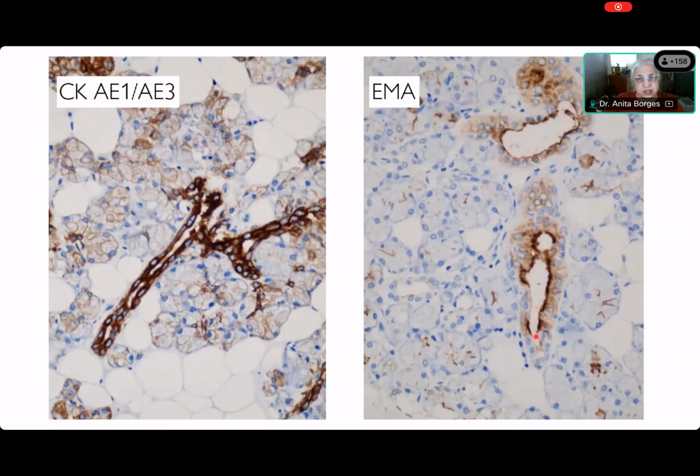expression of cytokeratin. This is something that we must understand, because if I am looking for something that I believe is acinic cell differentiation, then cytokeratin is not going to help me very much, because normal acini do not express a good amount of cytokeratin. Of course they do. It's an epithelial structure, so there is cytokeratin.